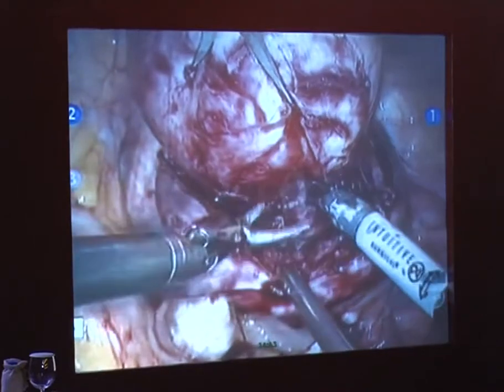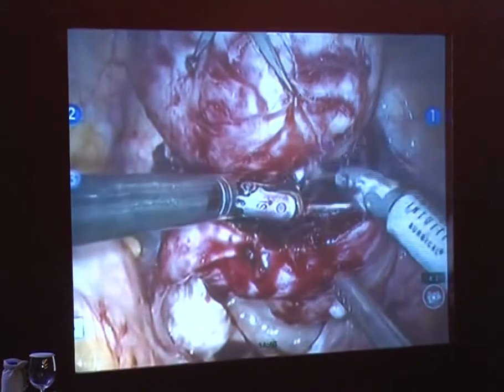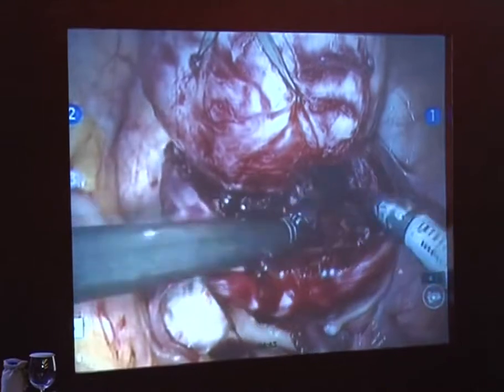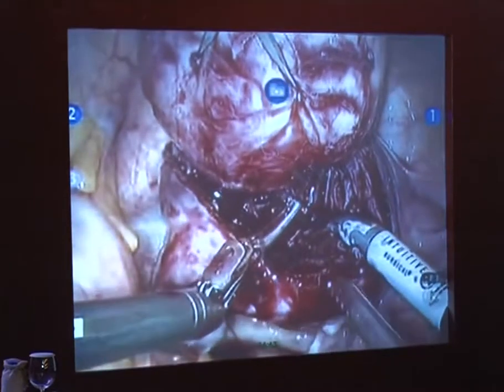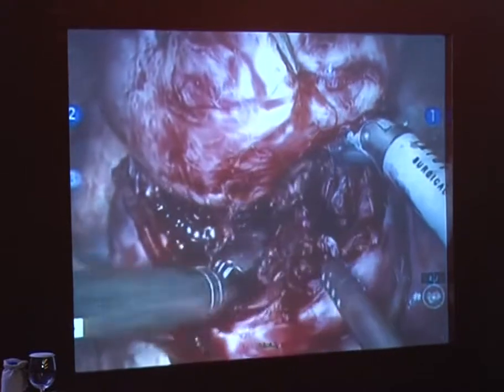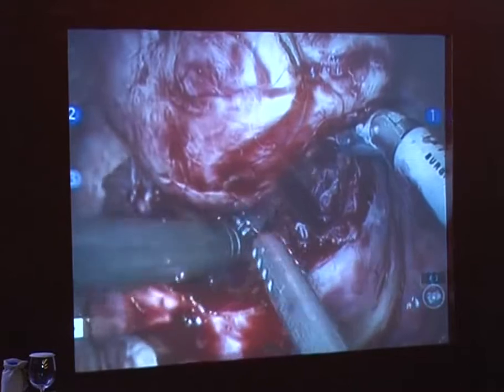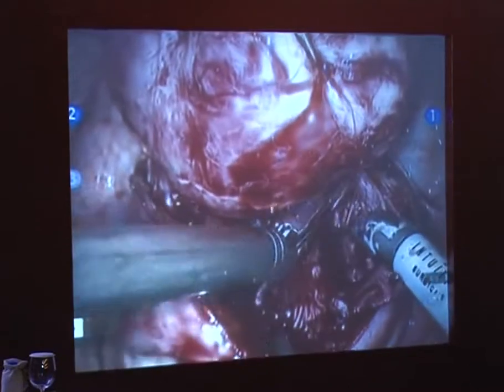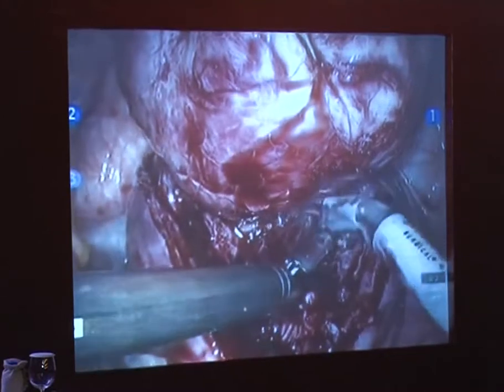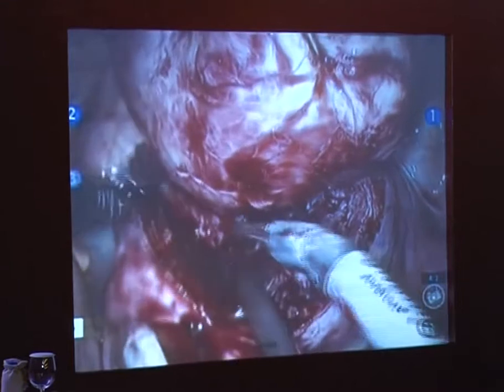What I said was, even though you're using the robot-assisted myomectomy, if they forget that you're using the robot, it is the same process that you do in an abdominal open myomectomy. It's the same technique. We're doing the same technique like we do open surgery. The goal is to not create a new procedure. I'm replicating the open technique.